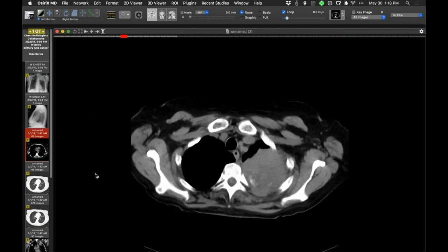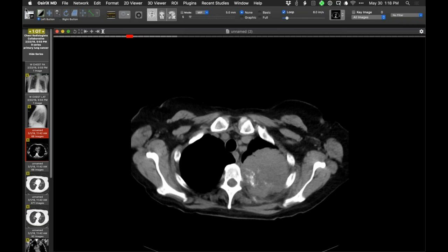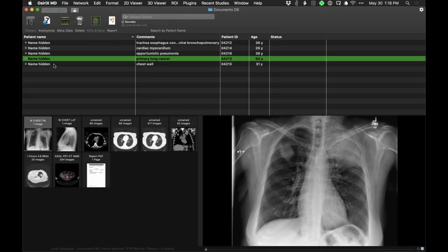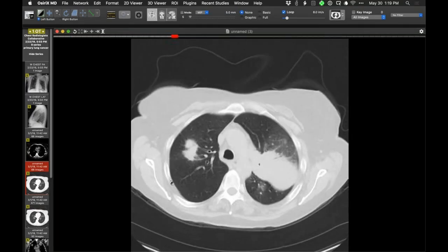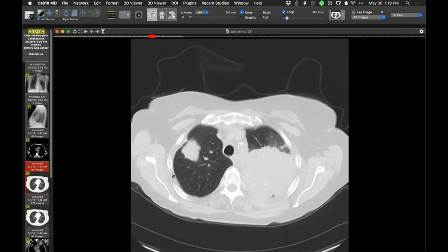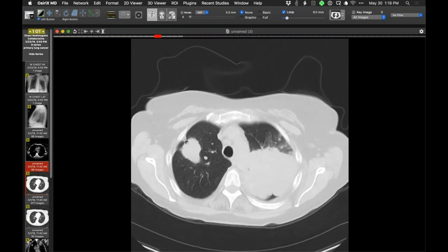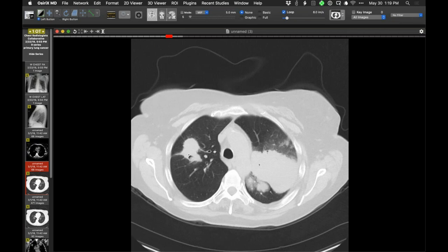Do we know the lesion on the right is also an adenocarcinoma? We don't - it wasn't biopsied. She does have metastatic disease and has been treated, so recently they decided it wouldn't affect management. It's pretty suspicious. On CT it's another large mass with lobulated, spiculated margins, and retraction on the pleural surfaces - very consistent with a synchronous tumor.